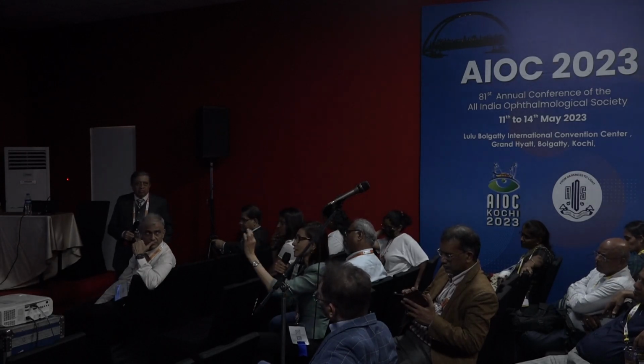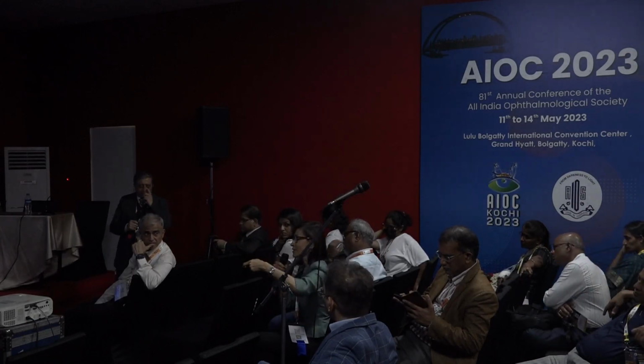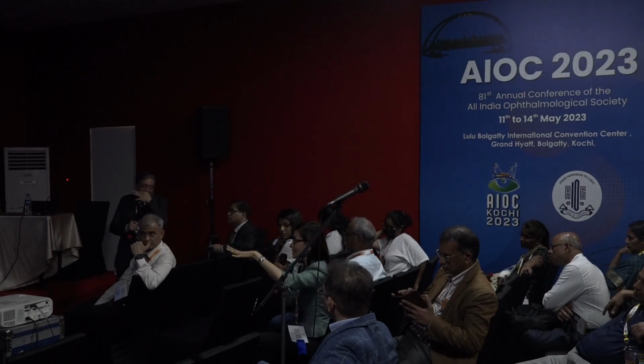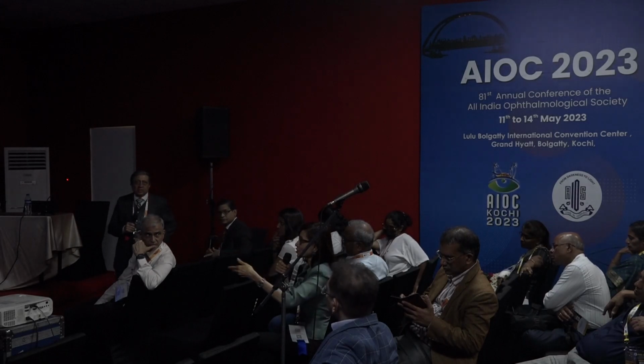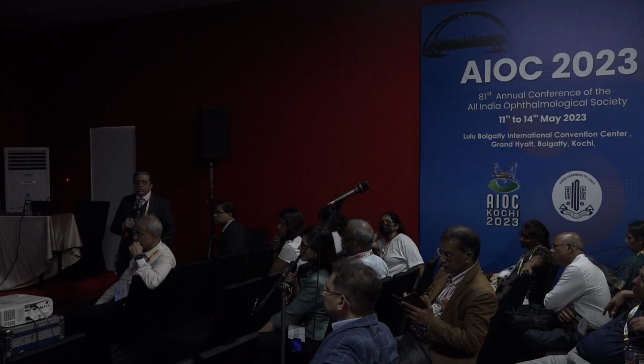Sometimes to make that small 2 millimeter rexis, I need to bring the cystitome out, because the cystitome doesn't always fashion the entire rexis since you don't have a lens under it. Once the small rexis is there, it's safe. You wash it out, put in some more, and you can make any size. Any different type of cystitome you prefer? A circular one like Dr. Rajinder?